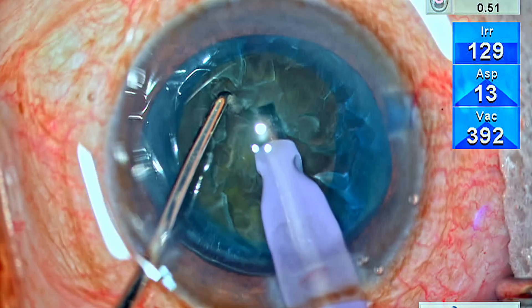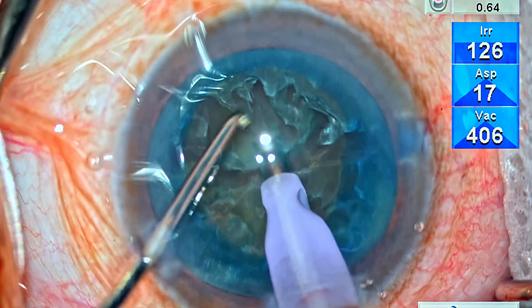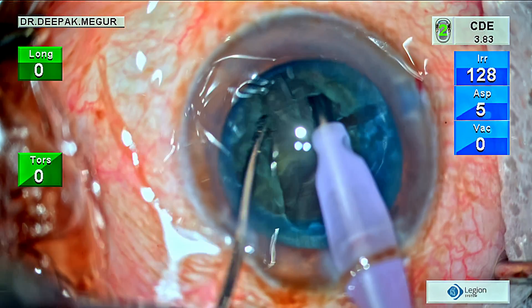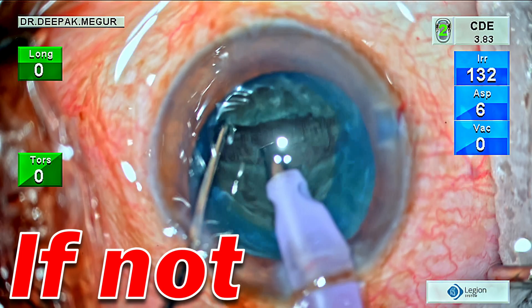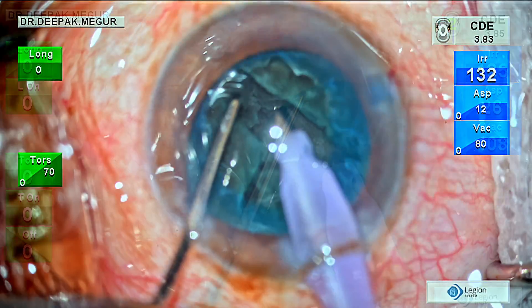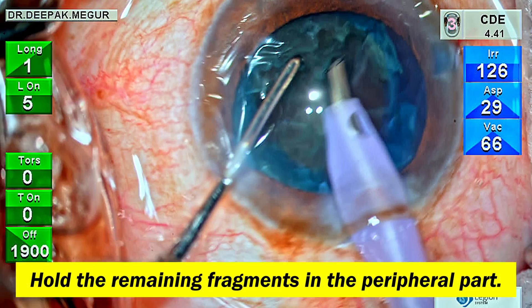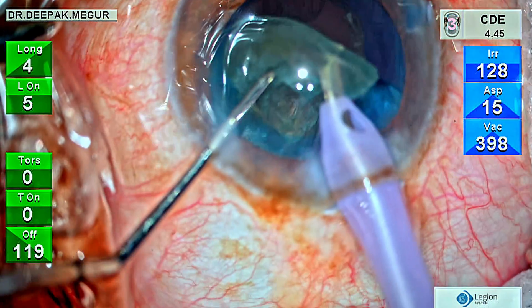To summarize: when you encounter an extremely soft, crumbly cataract that refuses to crack, the immediate strategy should be to convert to a stop-and-chop technique. Try to create a long thin trench, then attempt separation — if they separate, pull each fragment out of the bag and emulsify. There's no need to divide into four fragments. If division into two heminuclei fails, de-bulk the nucleus first to reduce its size, then hold the remaining nucleus at the edge and use just the vacuum to flip the entire endonucleus out of the bag and emulsify.